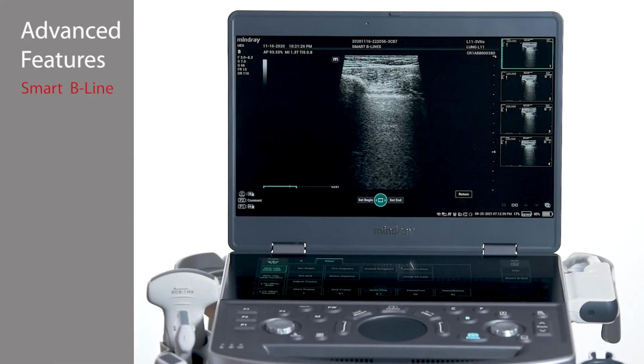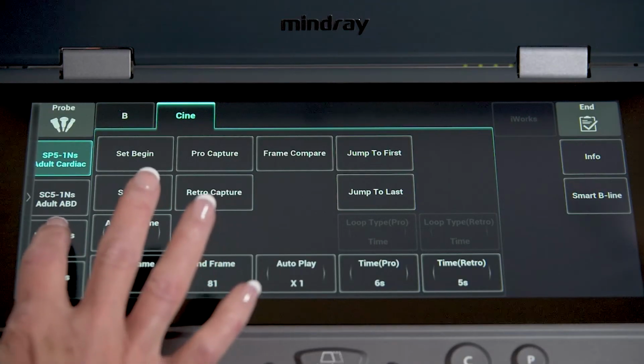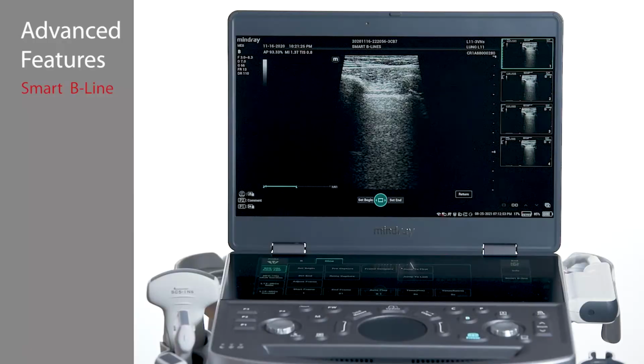Smart B-Line is an AI tool which will identify the pleural line and provide quantitative analysis of B-lines, as well as provide lung scores. Select the desired transducer and lung exam mode. The Smart B-Line function may be performed during live scanning or from a stored clip.